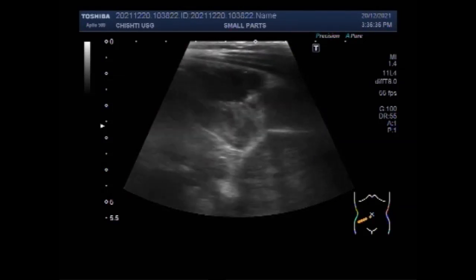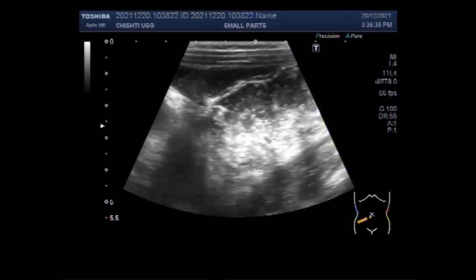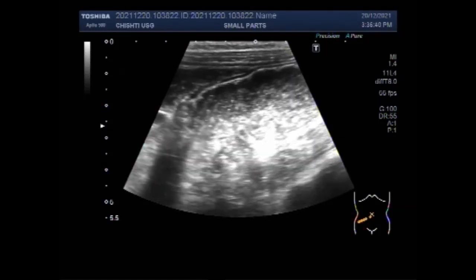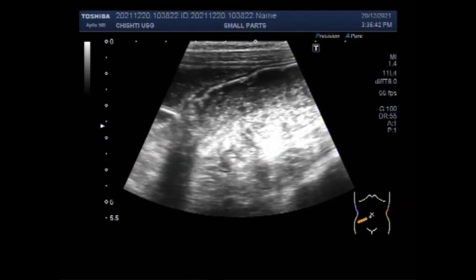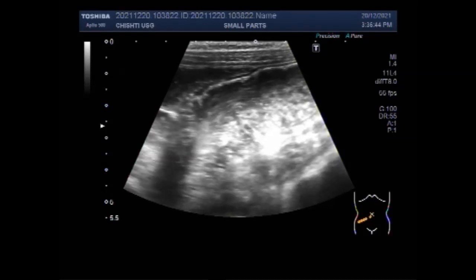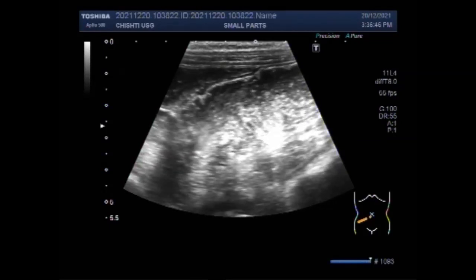You can see the gut loops and these are dilated with to and fro whirling movements of the intestinal contents.